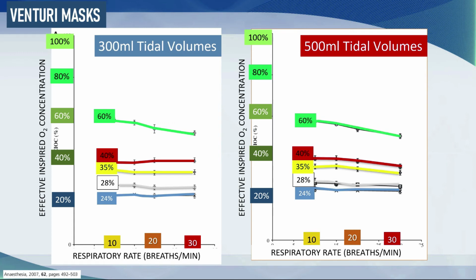And I put these on and I try them out to see. It looks like a magical number, but they really are quite robust in normal breathing patterns with a little bit of tachypnea, with slightly larger tidal volumes. They do really well. So they are tremendous devices and they're very, very effective for patients with moderate levels of hypoxemia. Where there's severe respiratory distress, you are gone. These will not work because of that big problem with the air entrainment ratio for higher FiO2s.